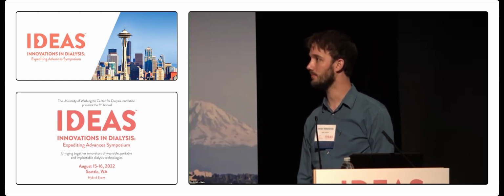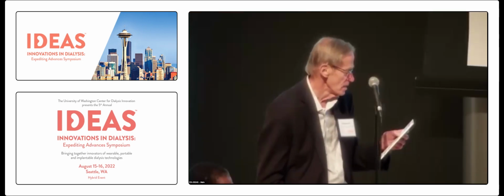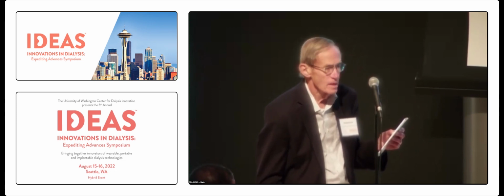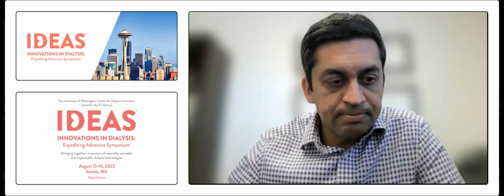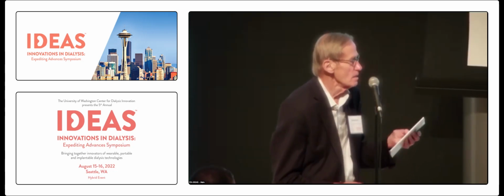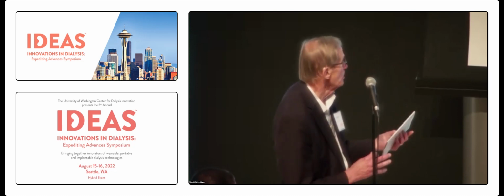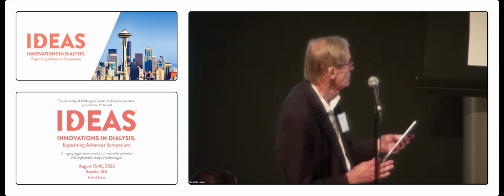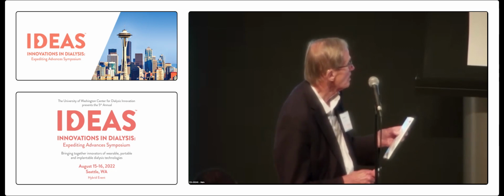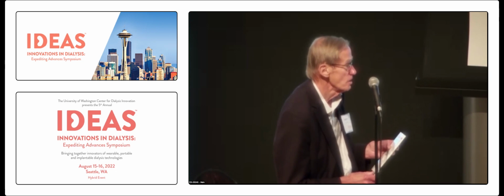I also had one for Dr. Kawar. A question from dialysis. Is he here? I'm here. Oh, yes. Hi. So you have two modules, one sort of a patient module and the other is the dialysate source. Is that right? Correct. You mentioned that the dialysate could be reused. So what kind of work are you doing in sorbent chemistry to regenerate that dialysate?